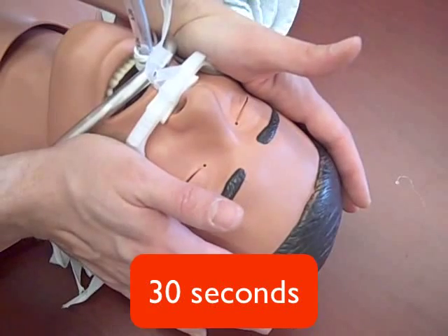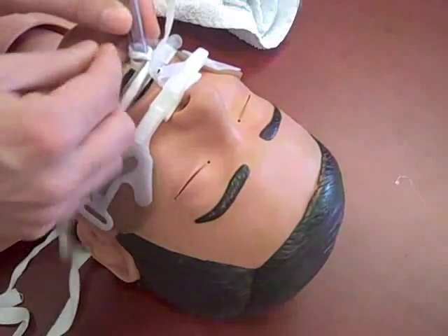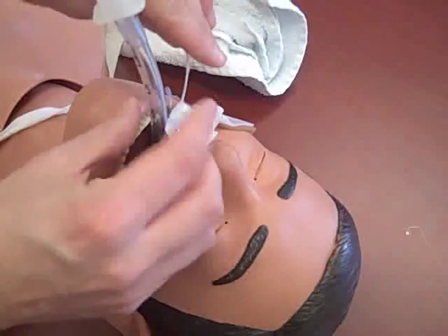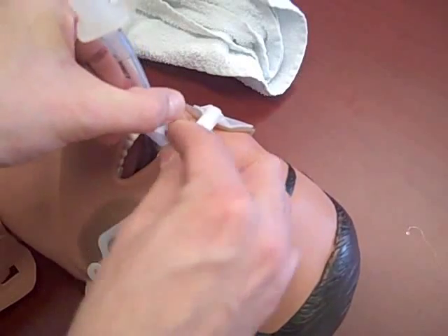Remove the old endotracheal tube ties. Remove the adhesive liner from the strap and wrap it around the endotracheal tube. Secure it with the holding clamp.